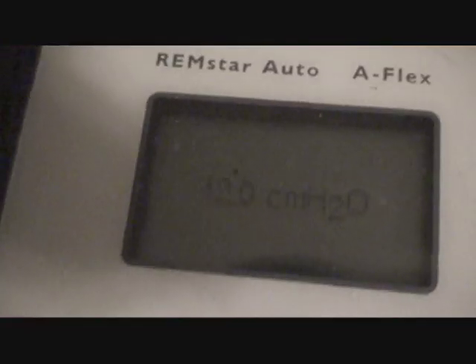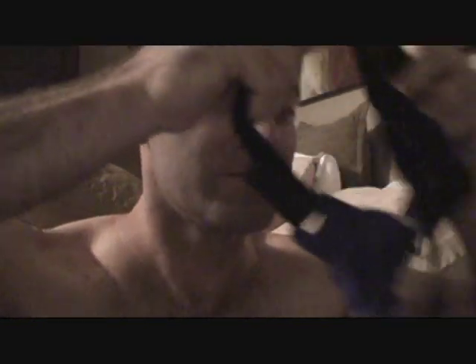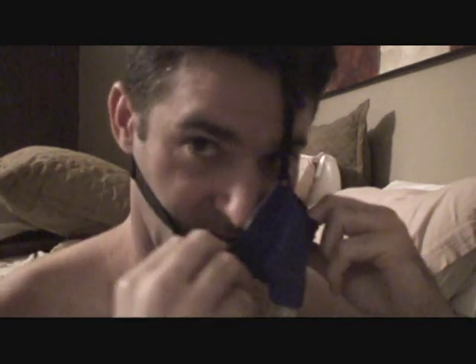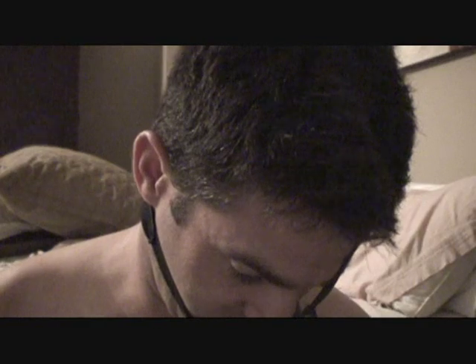This is the Circadiance SleepWeaver Advance pressure check, high pressure check. I'm doing it at 12 centimeters of water pressure. There's no silicone on it, no hard plastic at all. I found that with this, putting it on and then turning it on right now before it's actually on is the best way to go.